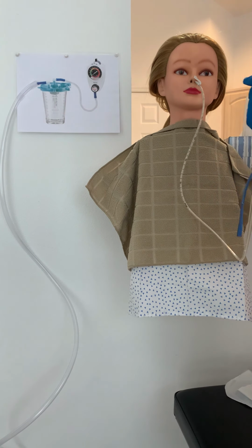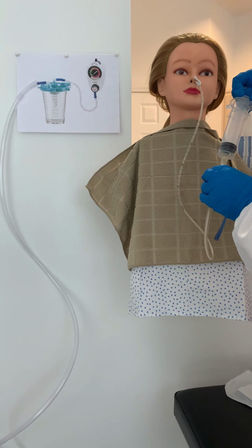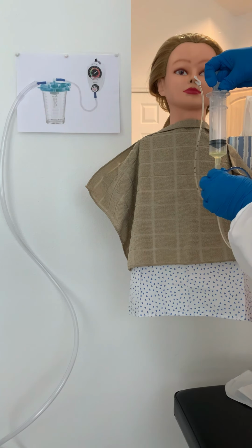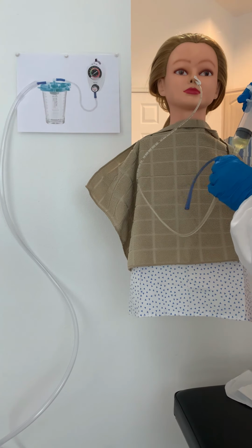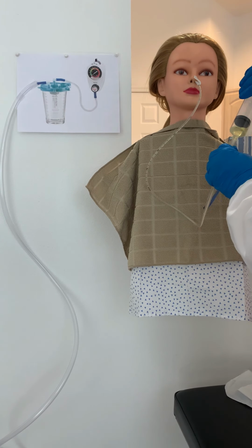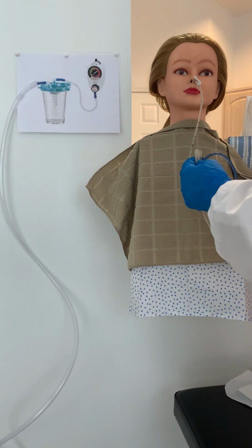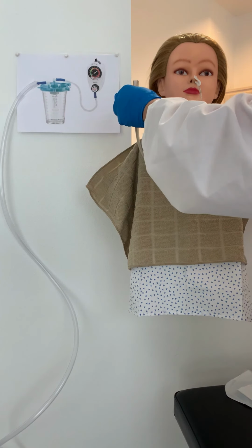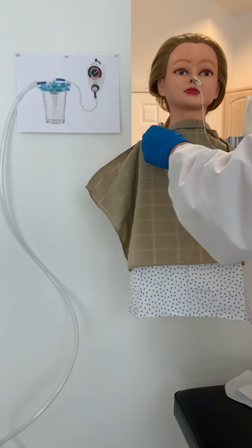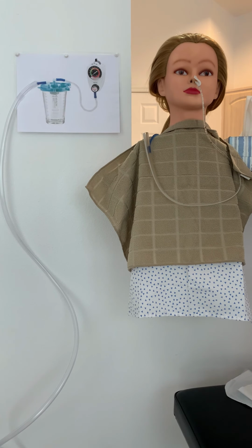But just to be sure, we're going to check the pH as well. So I'm going to draw back 10 milliliters of gastric content. I'd say that's about 10. Then I'm going to take this syringe out. Now, once I lay this down, gastric content will go everywhere. So I'm going to just leave this kind of aimed upright on the towel. Okay.